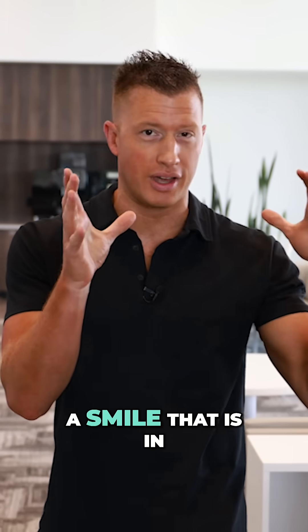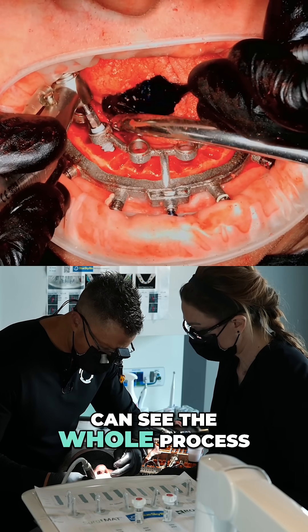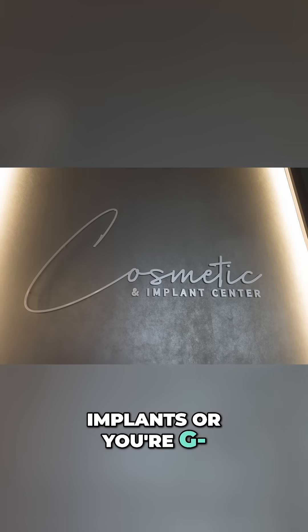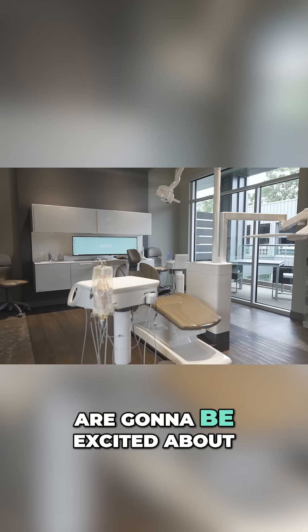It's going to be fascinating how we take a smile that is a mess and convert it into an amazing smile in one day. We're going to do this live so you can see the whole process. If you've done just a handful of guided implants, or you're kind of getting your feet wet in full-arch implant dentistry, or you just want to take it to the next level — that's the clinical aspect of it that docs are going to be excited about.